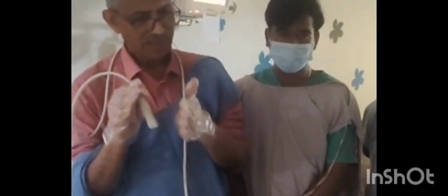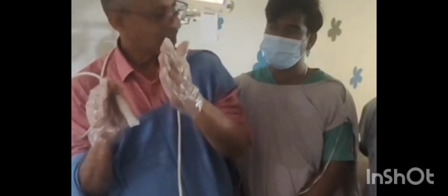So definitely there is significant dilatation of the coronaries. So what did we learn? How to position the probe, how to get the parasternal short axis view, identifying the right coronary cusp, left coronary cusp, and non-coronary cusp. From the right coronary cusp arises the RCA, that is the right coronary artery, and from the left coronary cusp arises the left coronary artery, which branches into the left anterior descending and left circumflex. So here both the right and left coronary arteries are dilated.